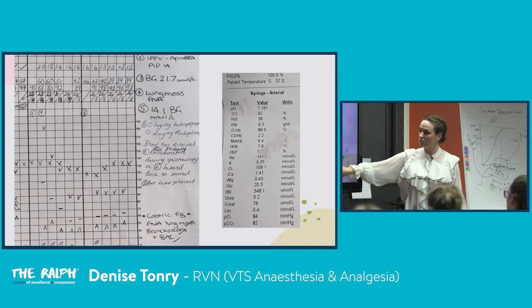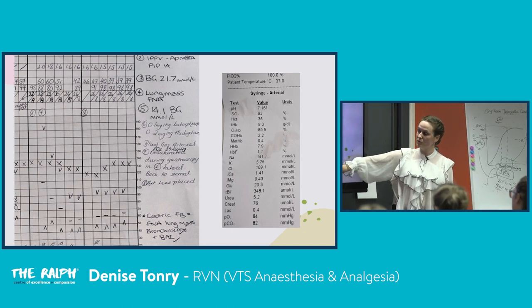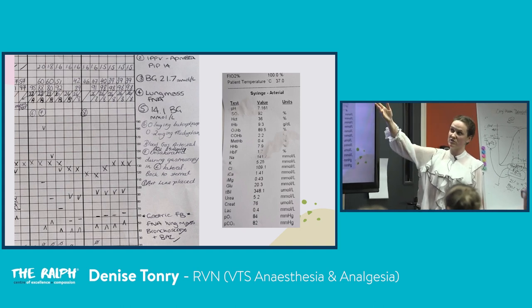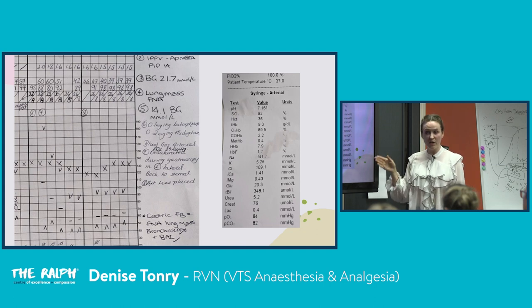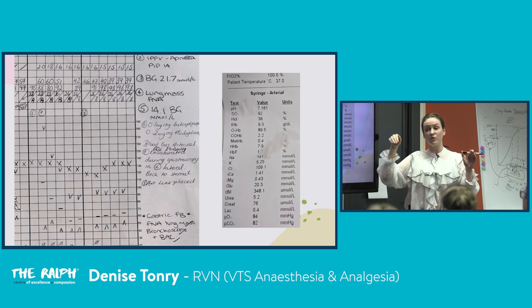So this is an issue when you start getting these increases in PCO2, the blood concentration of carbon dioxide versus what the patient is breathing out, which we're indirectly measuring, which is 57. And this is where you suspect a VQ mismatch. So you're having a ventilation perfusion mismatch. These lungs are potentially being ventilated, all the CO2 is being sent there, but there's no perfusion, or there's no ventilation.